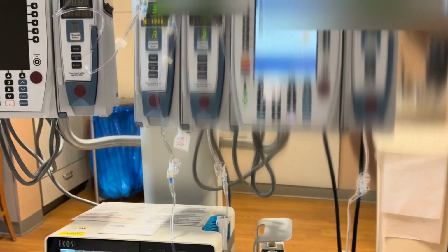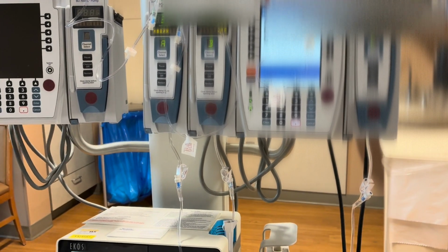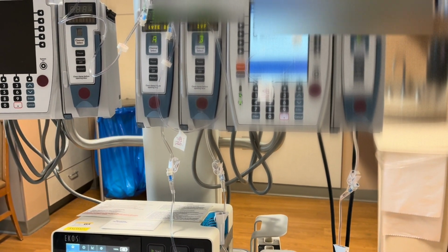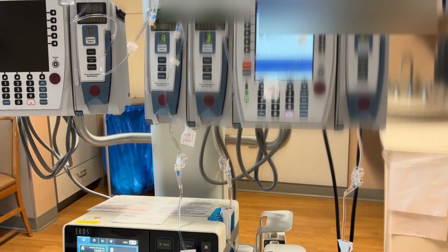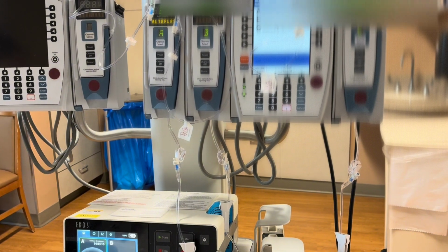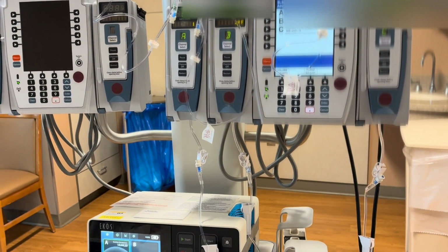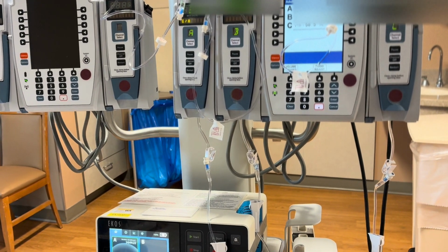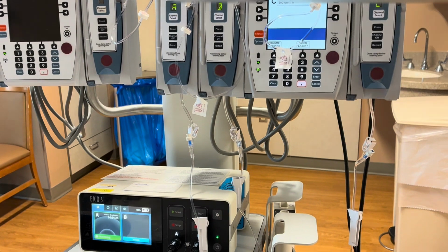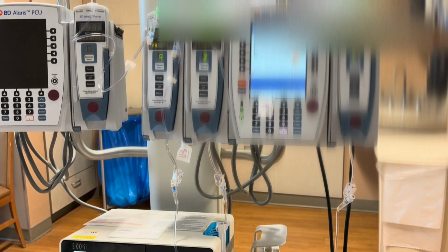Hello. Today we're going to remove an EKOS catheter on a patient who came in with shortness of breath. She actually had a syncopal episode. CT showed she has a pulmonary embolism, more on the left main. Yesterday she had what we call EKOS, or catheter-directed thrombolysis. Unilateral, so it was just on the left main, so she had that done yesterday.